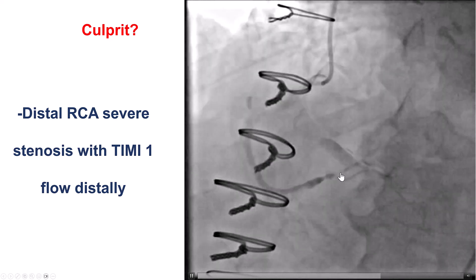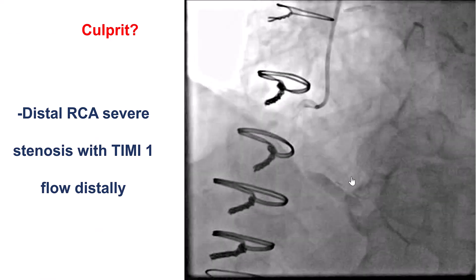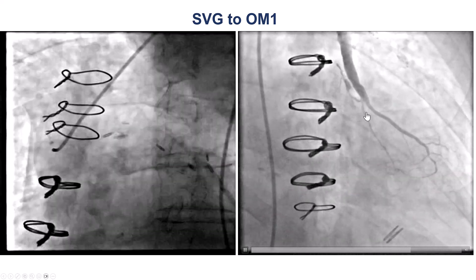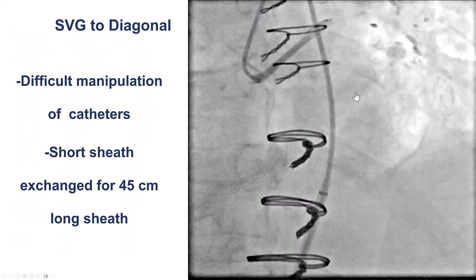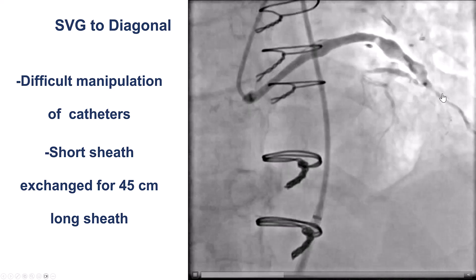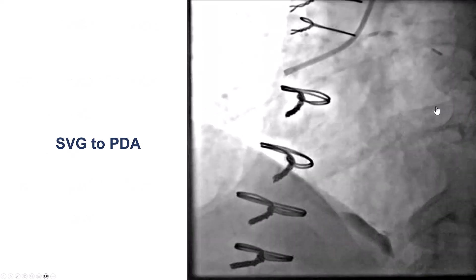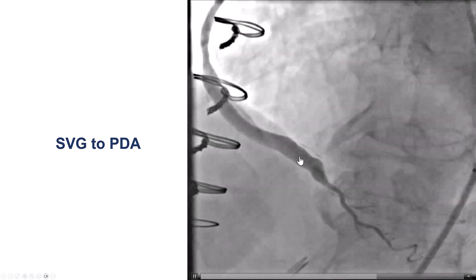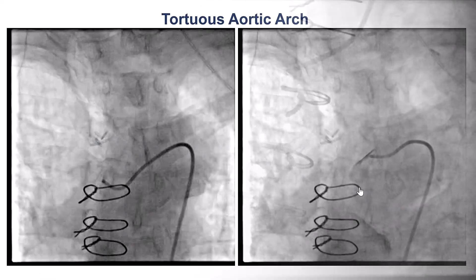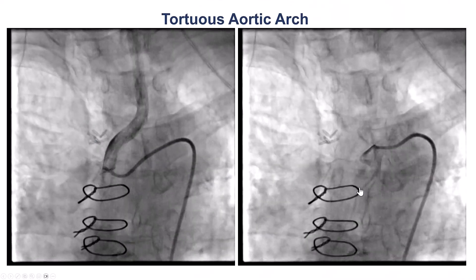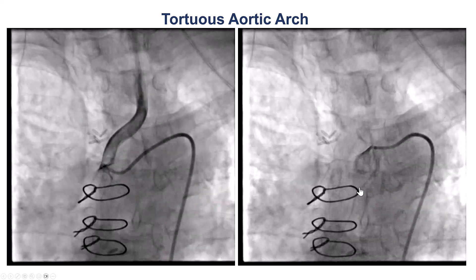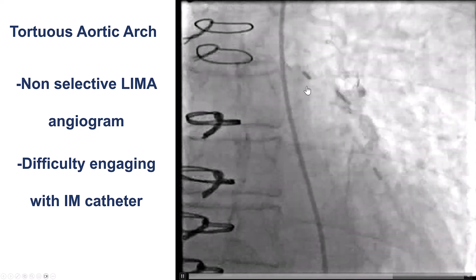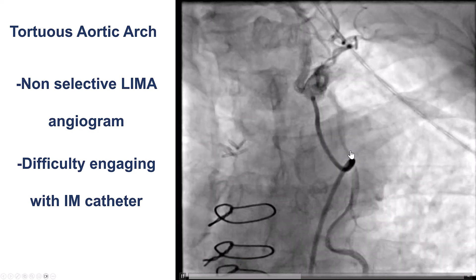On repeat injection, there is diffusely diseased distal vessel and the staining along the vein graft. There was a vein graft to the obtuse marginal branch that seemed to be okay with TIMI-3 flow and no significant disease. Then there was a vein graft to the PDA, which, although a little aneurysmal, also had TIMI-3 flow. We had a lot of difficulty getting into the aorta because of aortic tortuosity, but with non-selective subclavian injection, we did see that there was antegrade flow going down the LIMA.